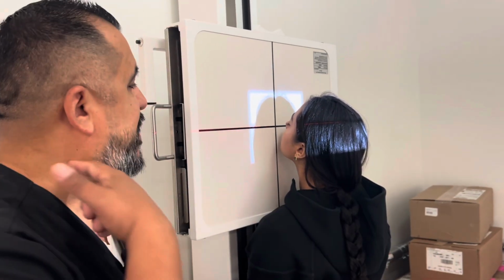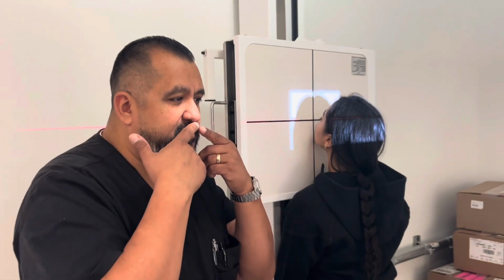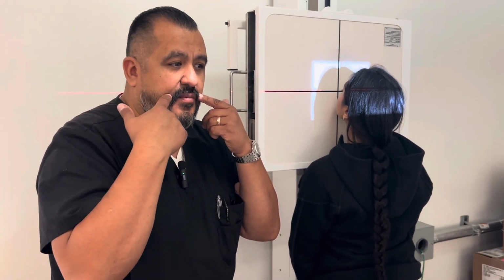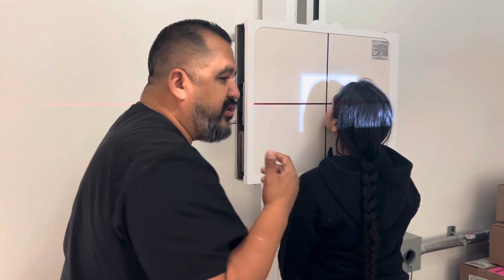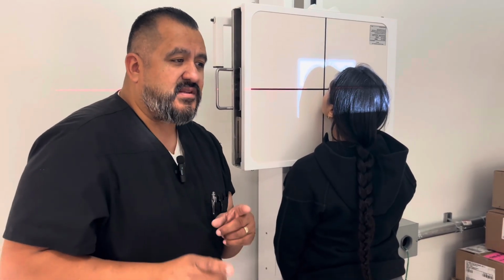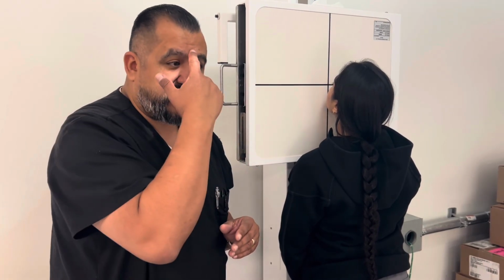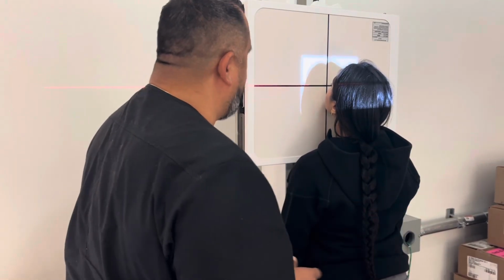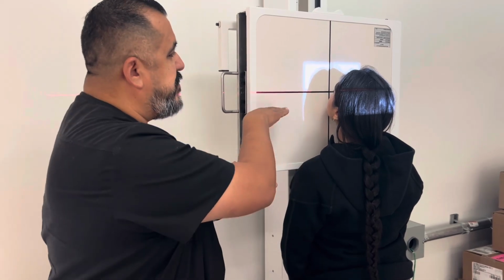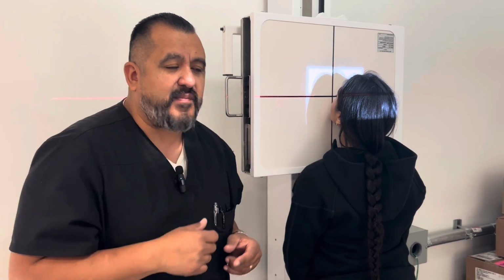I'm going to come down a little bit. I don't need to go past the mandible here. So keep your chin just like that. The Waters is really good to demonstrate the maxillary sinuses. We'll get some of the frontal sinus as well, but because she's at an angle, you're going to see that the frontal sinus is distorted. One of the items I wanted to mention on the Caldwell that we just did previously is that you see the frontal sinus and we also see the ethmoid sinus, okay? So this is a Waters, and again, your MML is perpendicular, you're exiting the acanthion, and it's primarily going to be done for the maxillary sinuses.